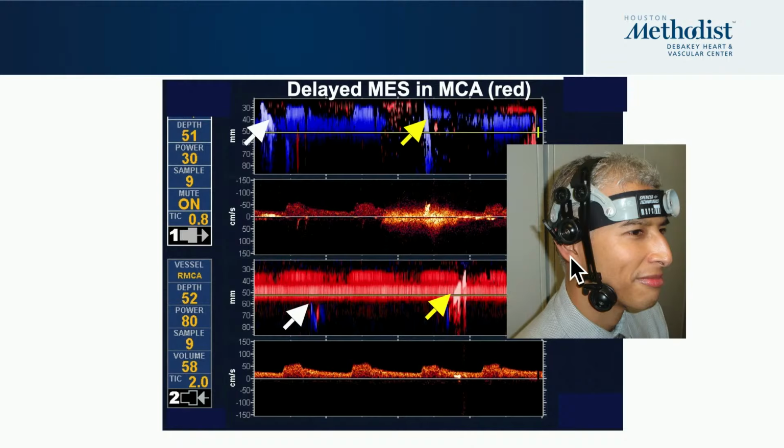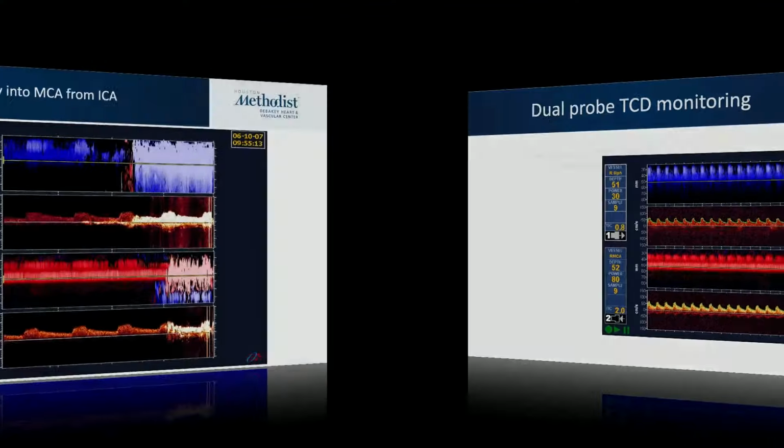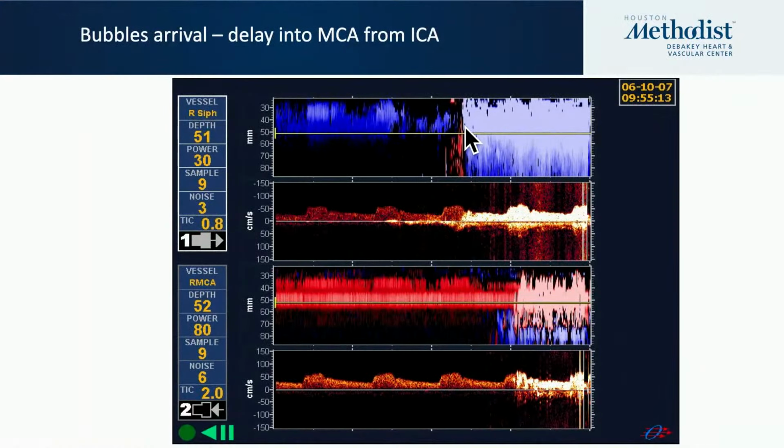So this is Dr. Chaltano, who was my research fellow buddy for a year. So he has the best photo with these dual transducers. This is how we were practicing on each other, and this is the best example that even without wires, you can still record some signals from his brain. And this is what it shows from the emboli shower from the submandibular to the transtemporal bone.